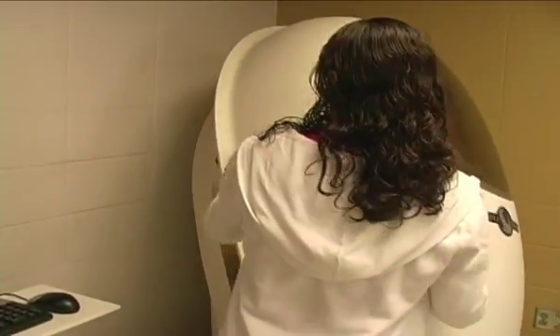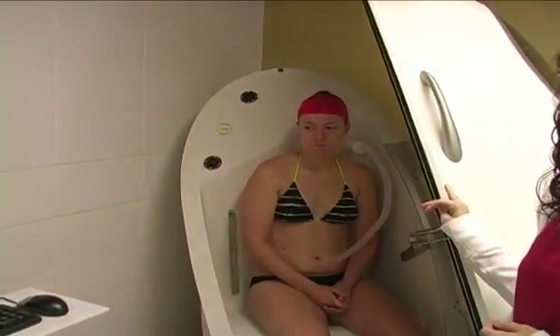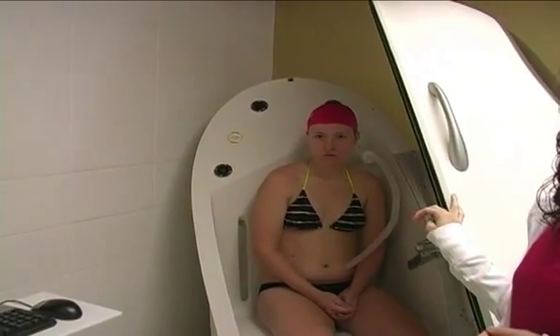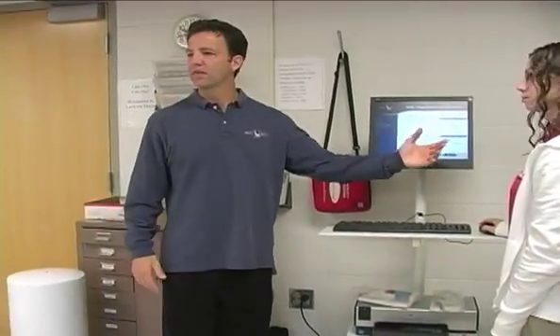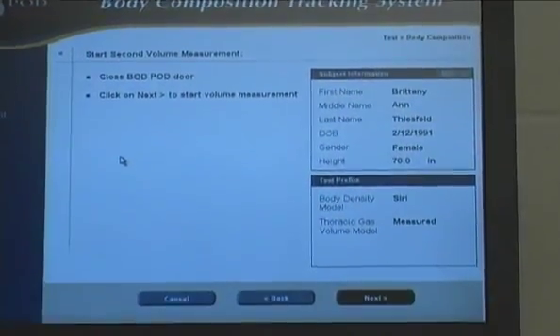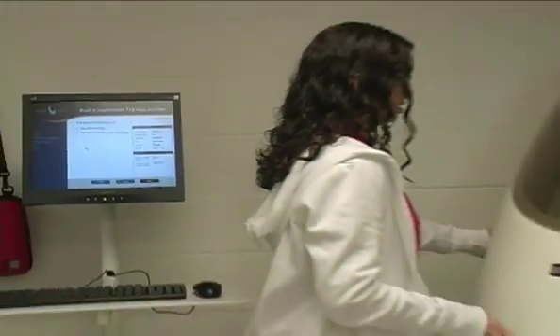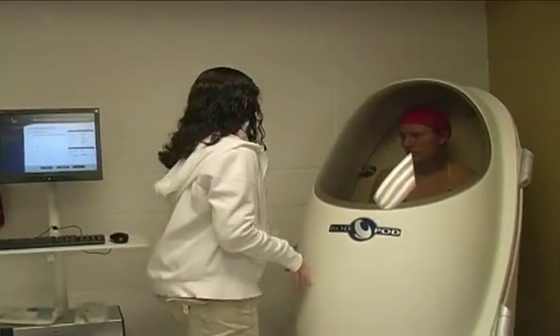How you doing, Brittany? You okay? Yeah. All right. Did you feel anything when you were in there? No. Feel okay? Yep. Some people, because we're changing the pressure slightly, it's a quick check, just make sure they're okay. And then open BOD pod door, click next. Close the door. Yep. Okay. And then click next.